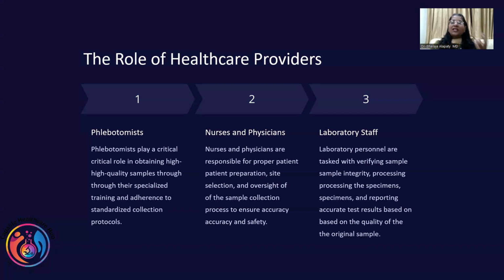When I say original, I mean from the moment the sample was taken from the patient's body to when you are actually putting it into the machines or doing the testing, till that time, the entire sample is exactly how we took it from the patient. How many of you feel that the samples we are collecting today are 100% the same when we start analyzing?